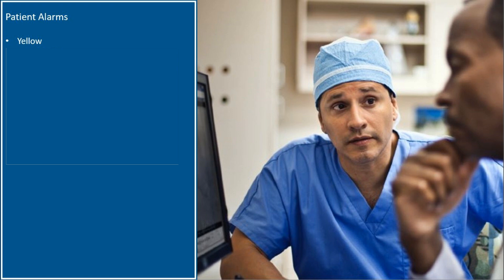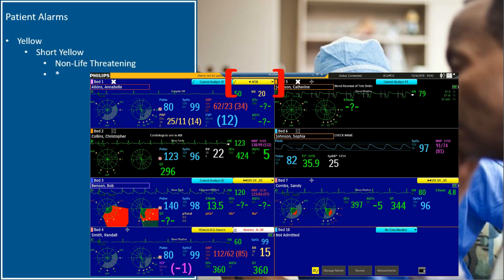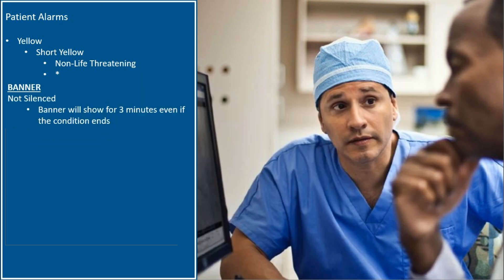Now let's look at the yellow alarms. There are two types of patient yellow alarms: yellow and short yellow. Both types are indicative of non-life-threatening alarms. Short yellow arrhythmia alarms display with a single star. If not silenced, the banner will continue to show for three minutes even if the condition ends. If silenced, the banner is removed.